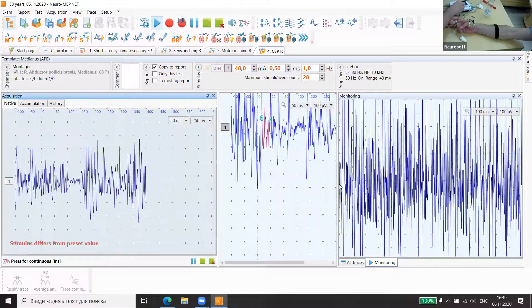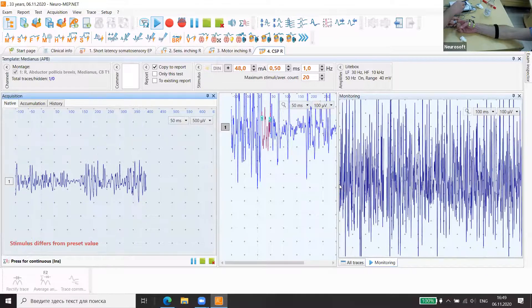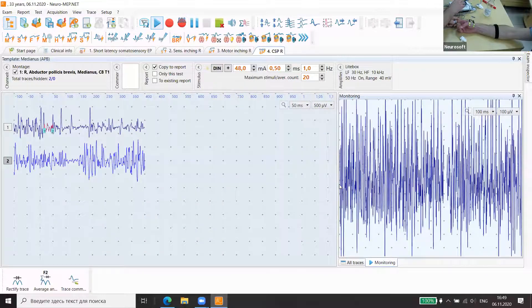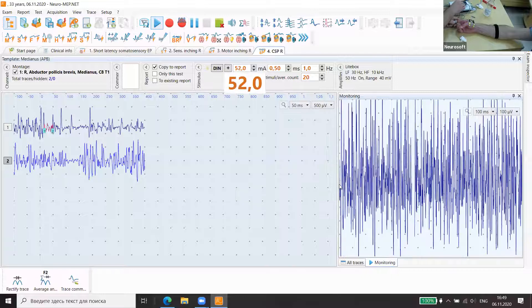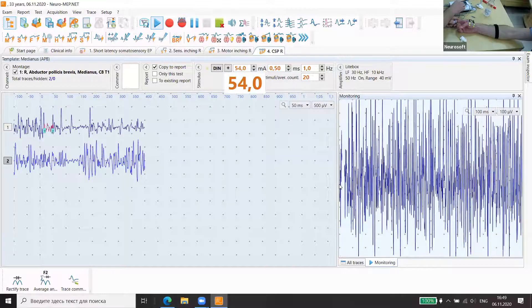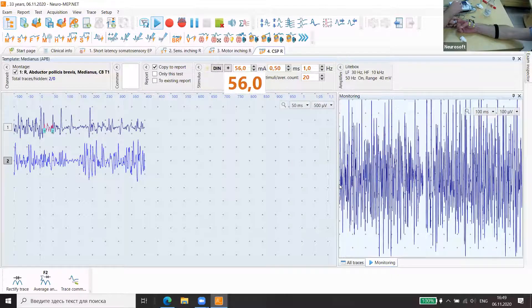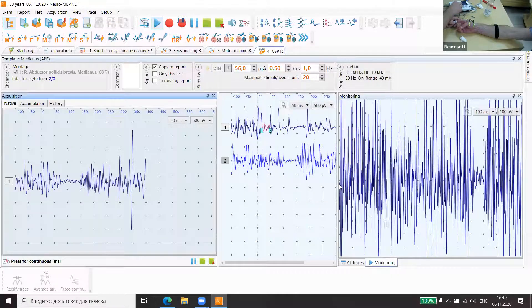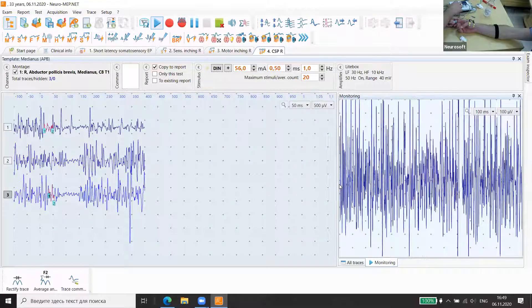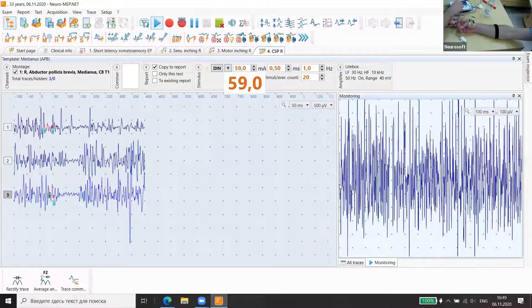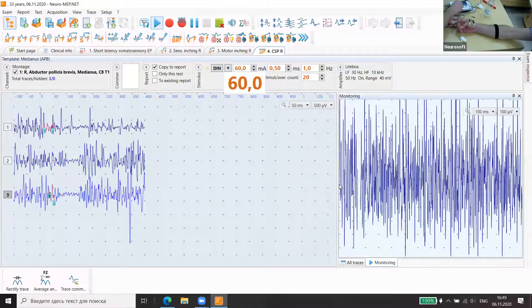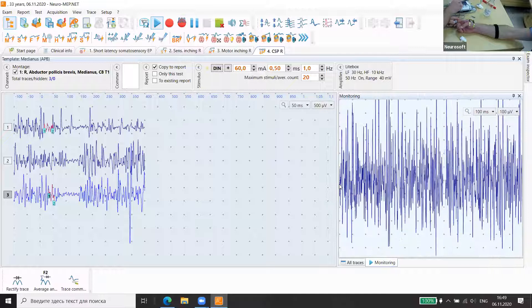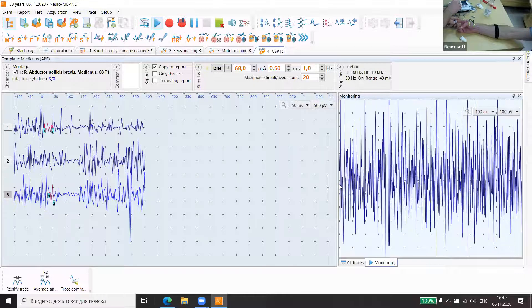It's the beginning of that, one, two, three. Yes. We can, you can see already at this stimulation level, one, two, three. Yes, okay. And the last time usually we need four to five times, one, two, three.